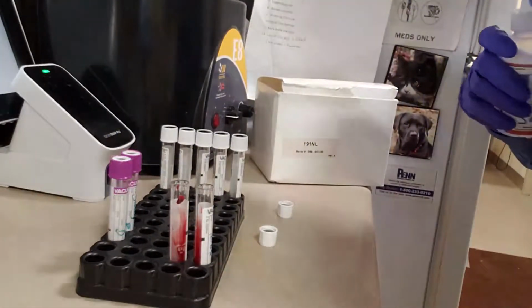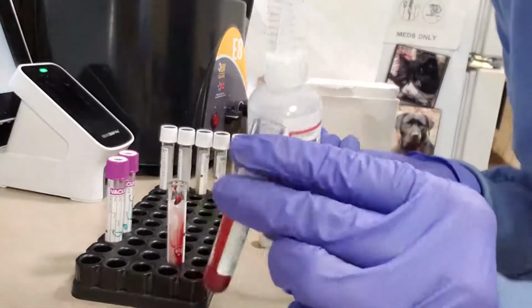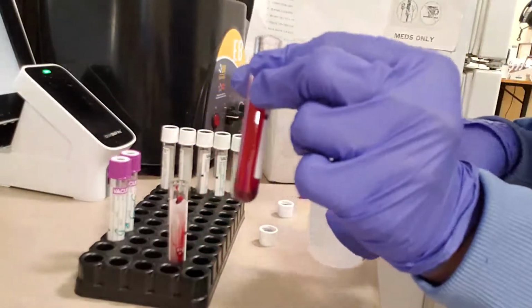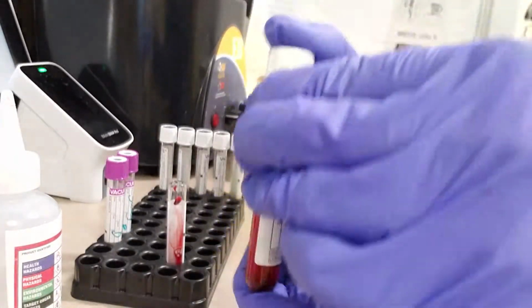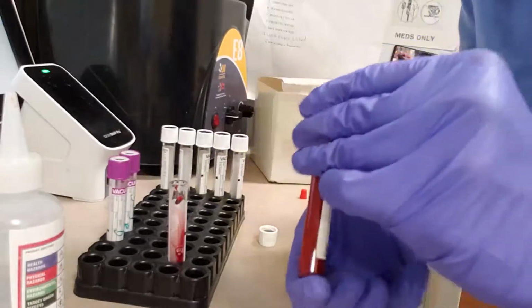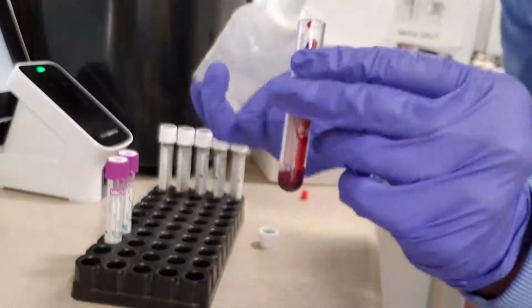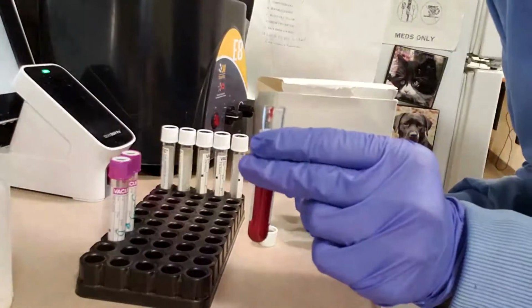So we have our saline solution, and we just want to do it about 3/4 of the way so that we know each red blood cell, or each drop of red blood cells, is getting the appropriate amount of saline. And then we want to just invert it to mix, and we will put that into our centrifuge. We want to do the same thing with our donor red blood cells. 3/4 of the way.